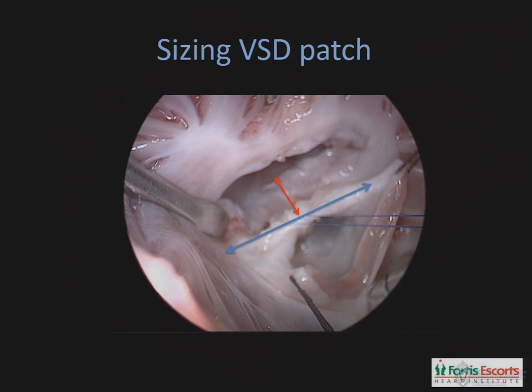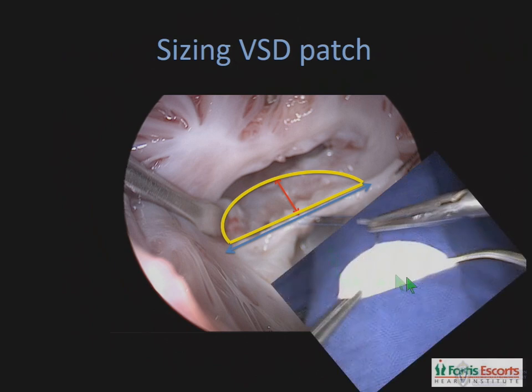Then we make an assessment of the size of the ventricular septal defect patch. You measure the length from the anterior commissure to the posterior, and then an assumed height. The stitch is important because you apply sufficient traction on the suture to align the leaflets together, and then we can get an idea of the height of the VSD patch. You eyeball the size and cut a patch of appropriate size. It's important that this length is slightly smaller than the assessed length, so we actually perform a slight degree of annuloplasty of the mitral valve.